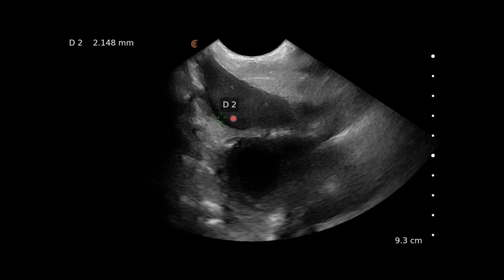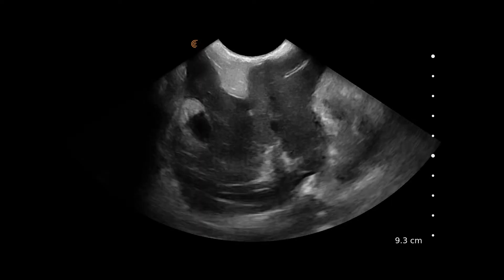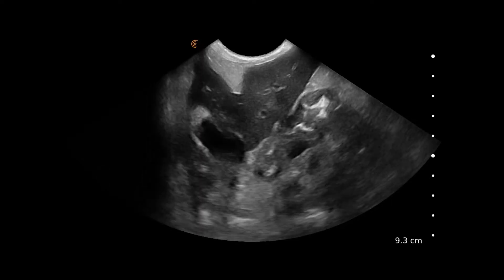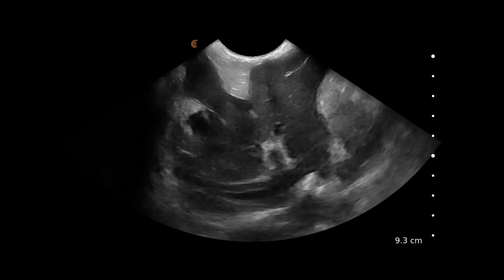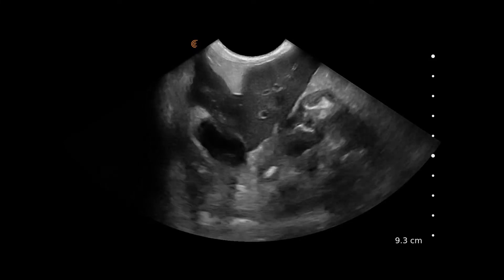Measuring the free fluid can give us an indication of how much there is and also allow us to quantify if it is changing over time. Fanning through the liver again here.